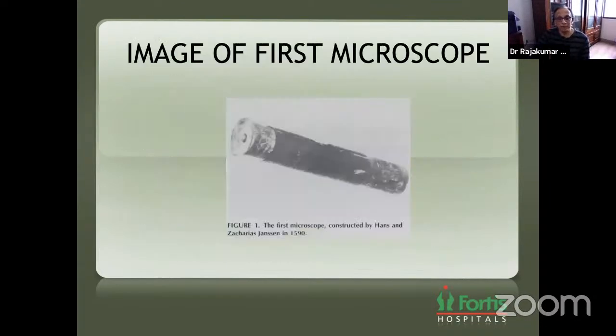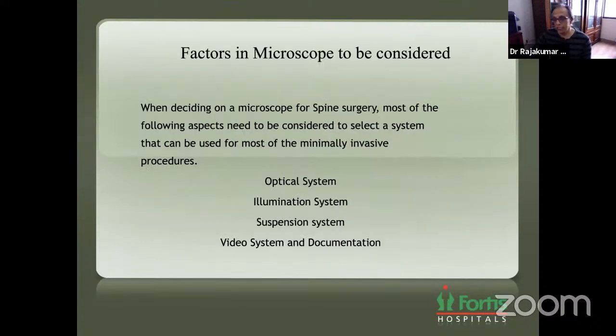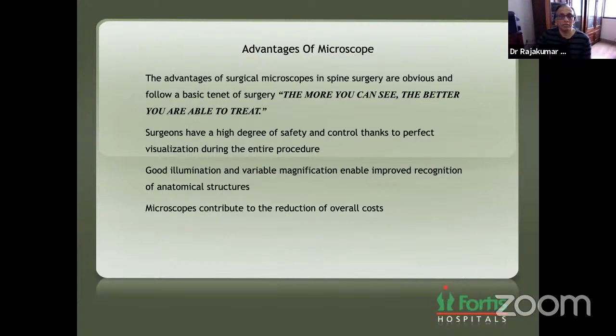So this is one of the oldest microscopes that was ever designed, the first microscope by Zacharias and Hans Janssen in 1590. Zeiss were the pioneers, and other companies do it nowadays. And I'm going to show what you should understand about the microscope that makes it so beautiful for surgeons to use. My friend Murali has already spoken about the optical system, the illumination system, suspension, video system, documentation.